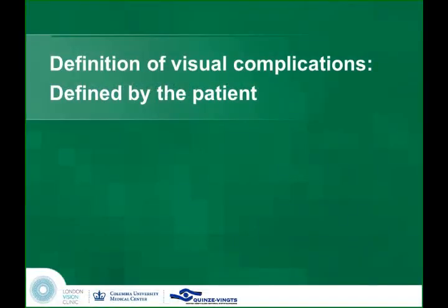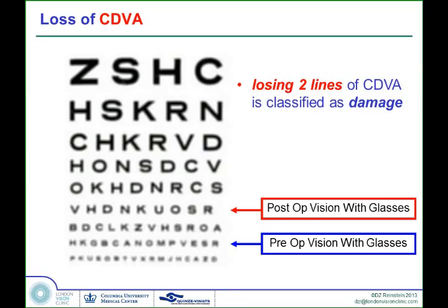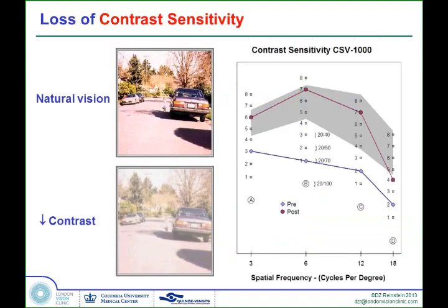I think it's very important for us to define something right at the beginning, which is what do we mean by visual complications? Because we've all seen topographies that are very decentered and the patient not complaining. So what we're talking about here is the difference between what some surgeons might say, but you see 20/20, and the patient says, but it's not clear. That's the other end of the spectrum. And obviously, loss of contrast sensitivity, measuring contrast sensitivity, in my view, is a critical component to being a refractive surgeon at all, because someone might start with low contrast, and if you decrease that a little bit, you could tip them over into being non-functional.